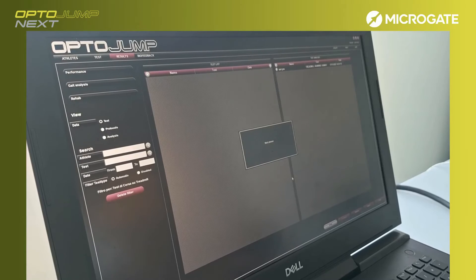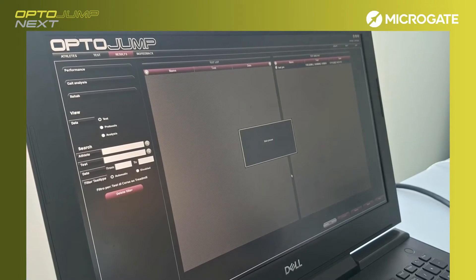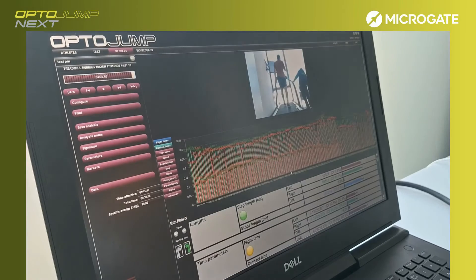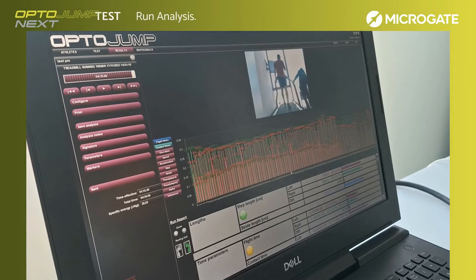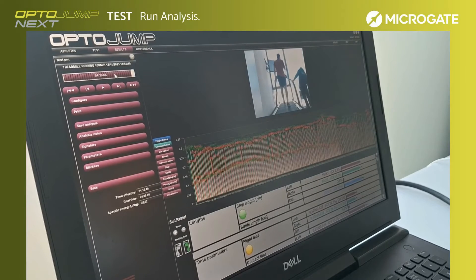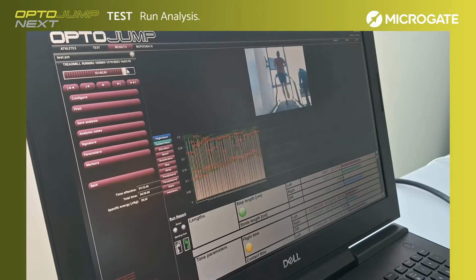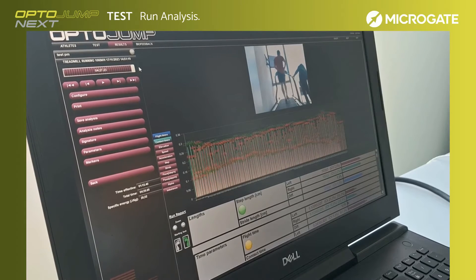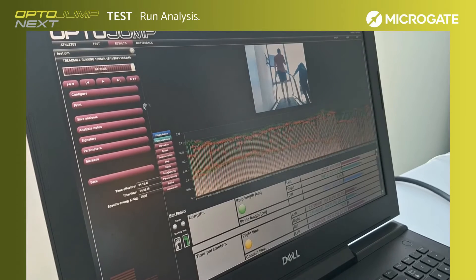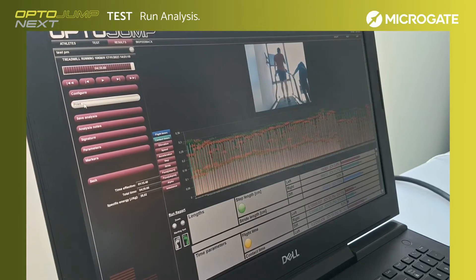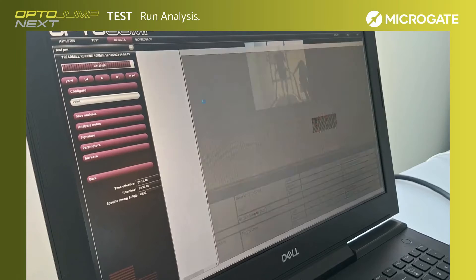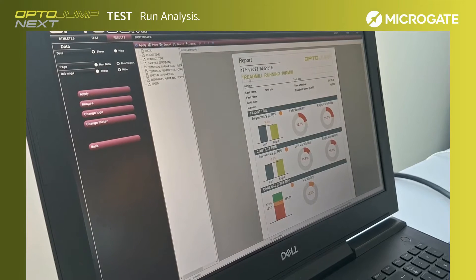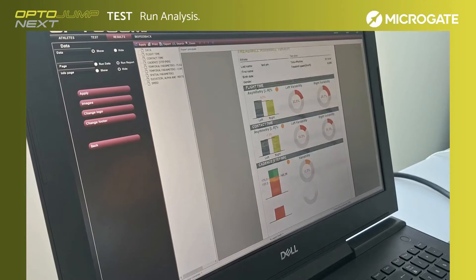From the results section, it is possible to resume the test and study the acquisition of the measured values together with the video. By selecting Print, the system will display an initial report view showing the averages of the main parameters, such as flight time, contact time, and cadence time.